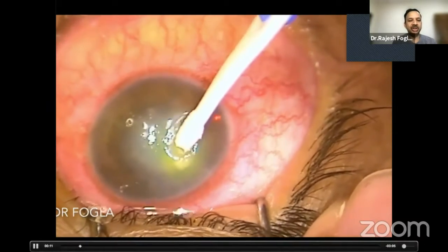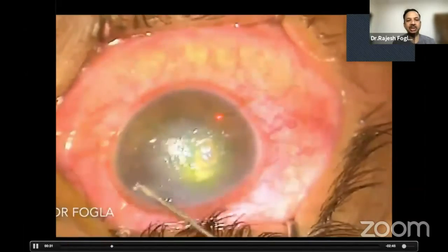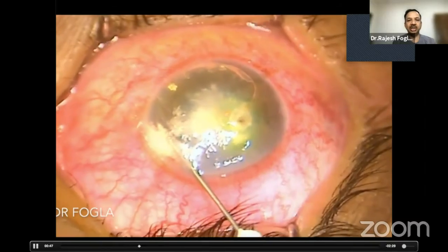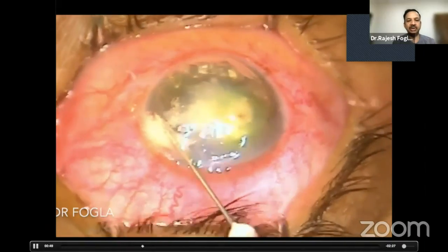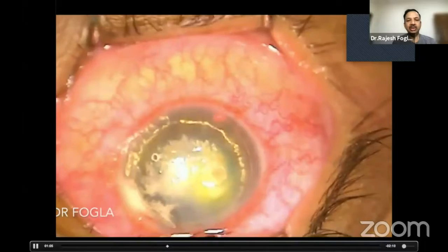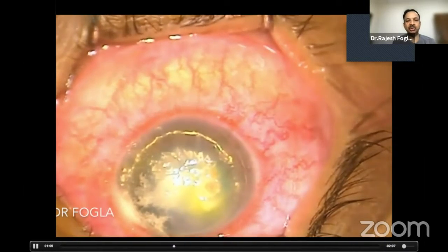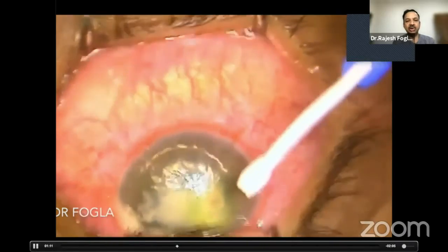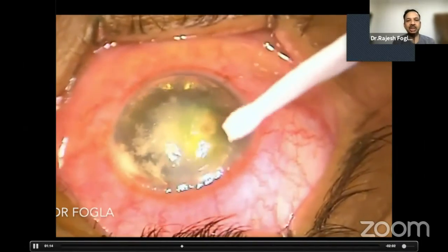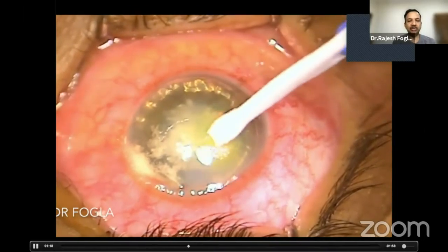For this, what we do is we place an air bubble in the anterior chamber using a 30 gauge needle. Once you place the air bubble, the surface can be made dry. You can see that now there is no seepage of fluid. It's important to debride all the surrounding loose epithelium or exudate that's sticking around the ulcer, otherwise the glue will not get a firm hold.